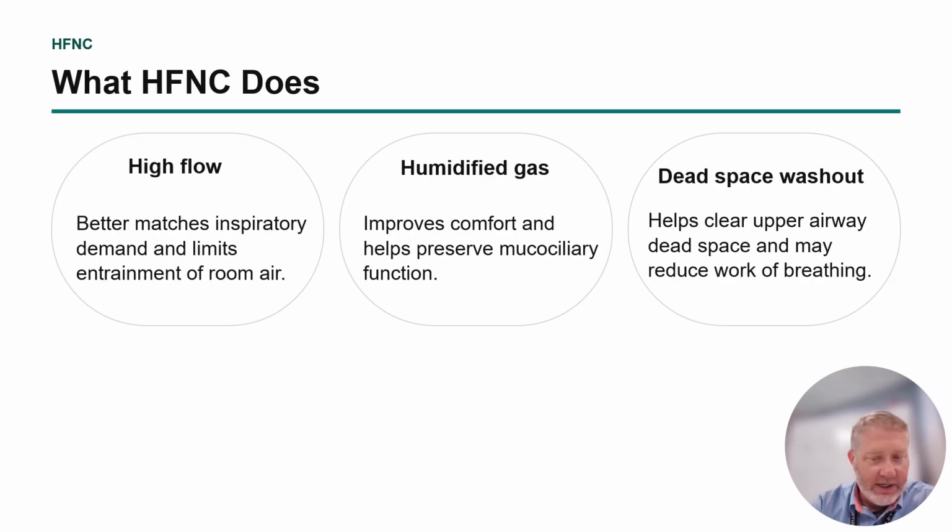As far as the physiology of high flow nasal cannula, the biggest thing it does is wash out dead space in the upper airway, so in the nasal cavity, the nasopharynx, things like that. That can help to reduce a patient's CO2 and their CO2 rebreathing, and help to slightly decrease their work of breathing as well. But it's not a great thing for somebody with a ventilation issue.